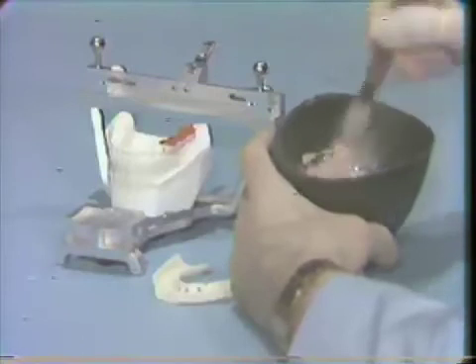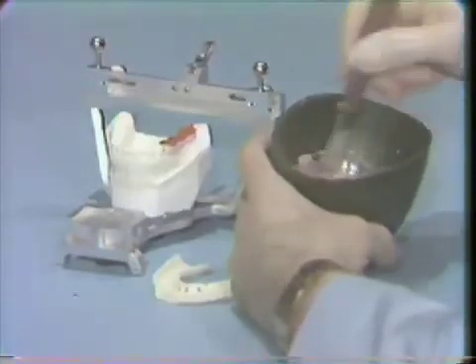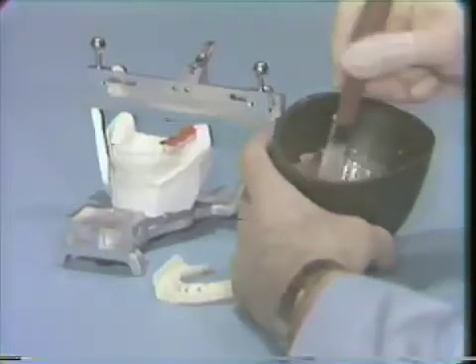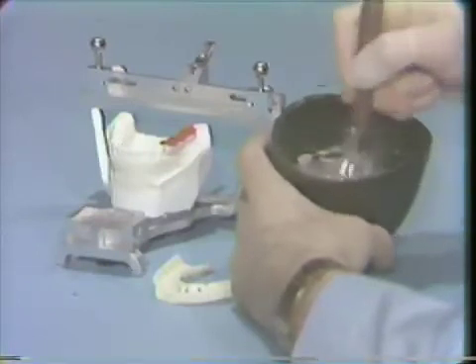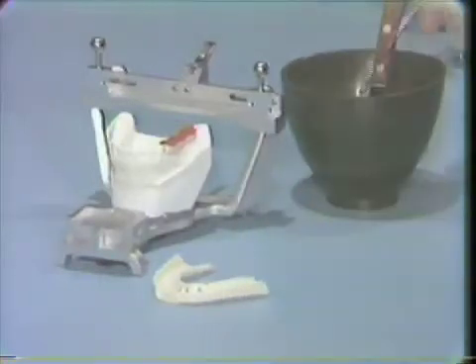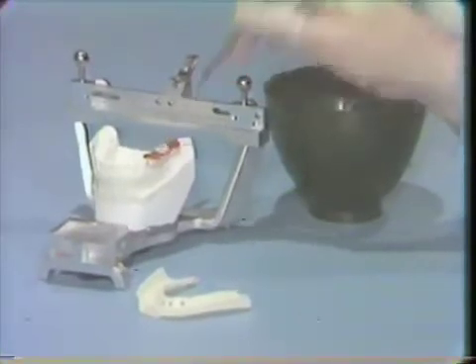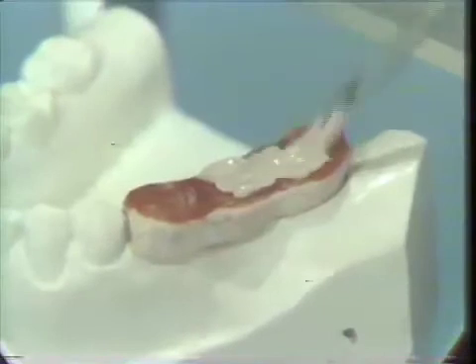Because of the warmth of the television lights, we'll mix this to a more fluid consistency than what we would normally do under an operatory situation. And after we have mixed the material, we'll take a paintbrush and apply a sufficient amount over our functional chew-in so that we get a good bubble-free registration.